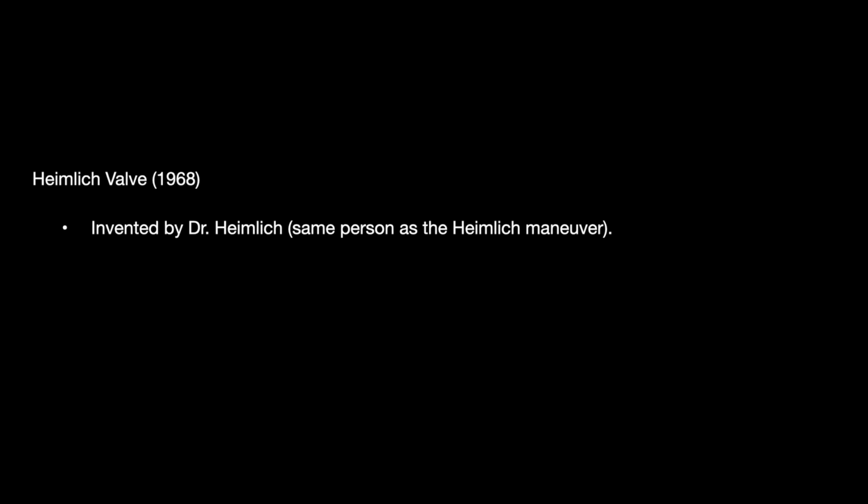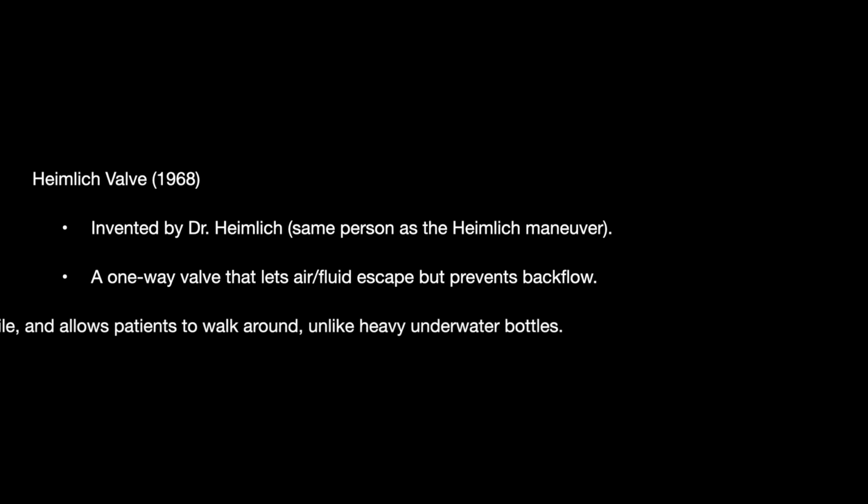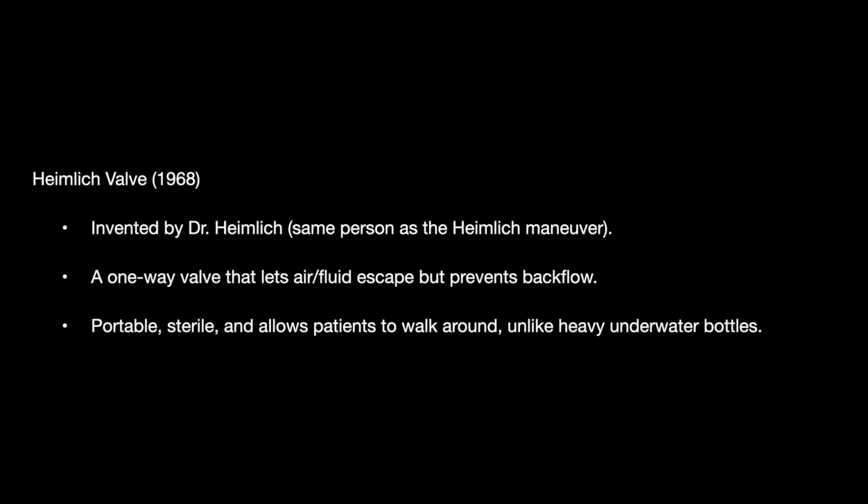So we had something called the Heimlich valve in 1968. It was introduced by Dr. Heimlich, the same person who had the Heimlich maneuver. It's a one-way valve that lets air and fluid escape but prevents any backflow. It is portable, sterile, and allows the patient to walk around, unlike the heavy underwater bottles that you have seen in the photographs. So now the chest tubes and the types of their usage.